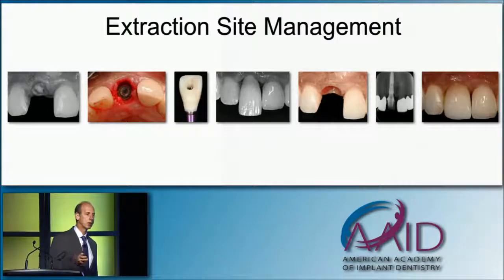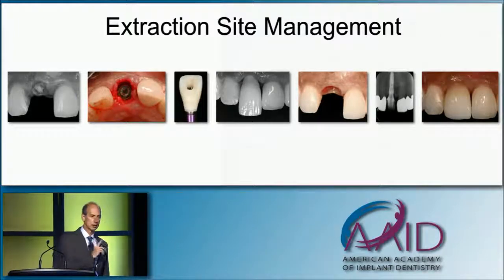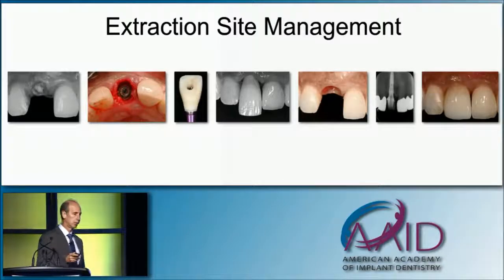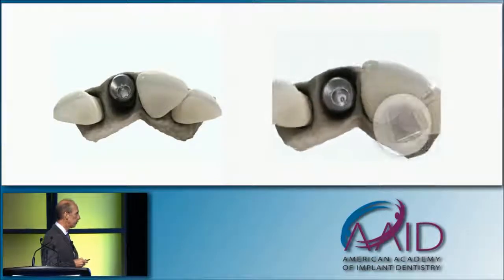It's not my goal today to teach people the method by which you see single tooth implants being performed here, but there are many steps along the way which have been informed by data regarding the biology of wound healing in this site, the biology of osseointegration in this site, and the biology of peri-implant mucositis in this region.